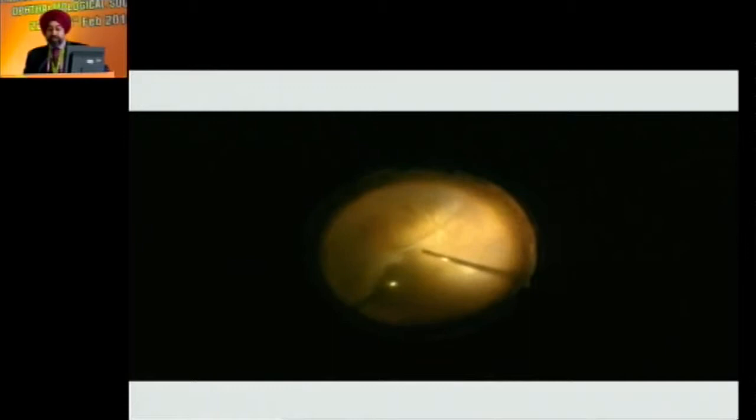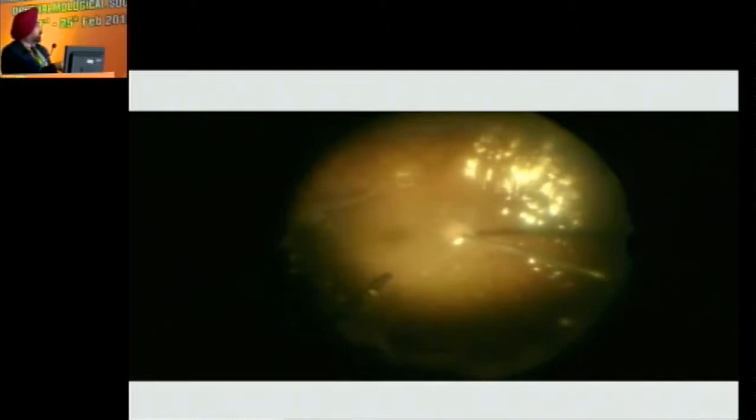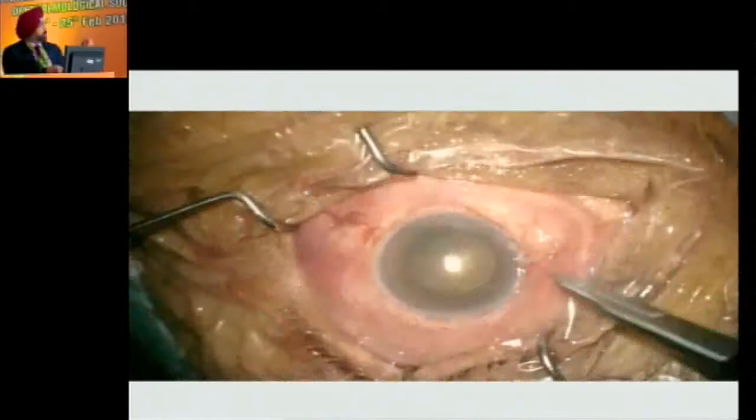This is another one. I wanted to show the atrophic and the normal retina, and the space between them. You see this active margin here. This is atrophic, this is active. I created a retinotomy in the normal retina, and this is how you go all around and laser the margins. You don't have to go over these. I created a retinotomy here, went all around, and gave oil in these patients. It's again a phakic eye.